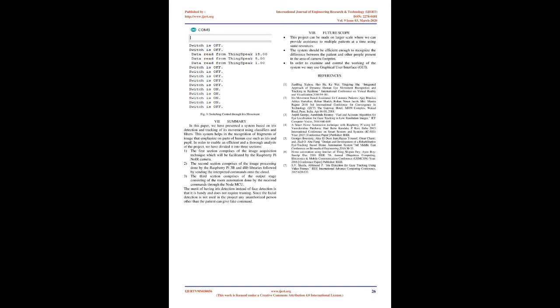These values are used by Node MCU, which is used as device controller. Node MCU can access the cloud by including header files and libraries and mentioning the channel name. Include thingspeak.h. The code words are used further to switch on/off the electric appliances, and the GSM module is used for panic call, activated by chaotic movement of the iris, which will allow the doctor to regularly monitor a patient's condition.